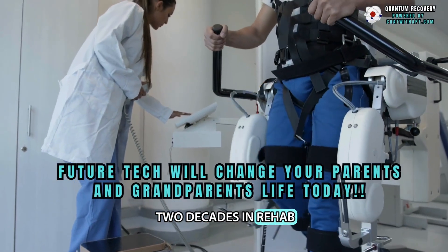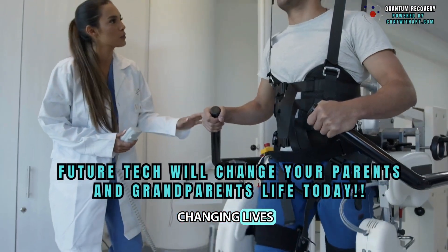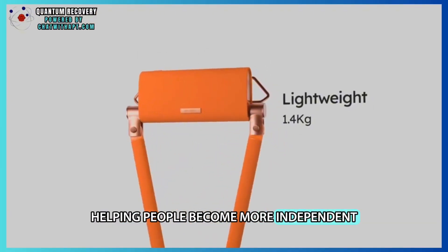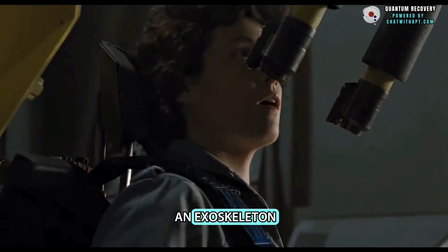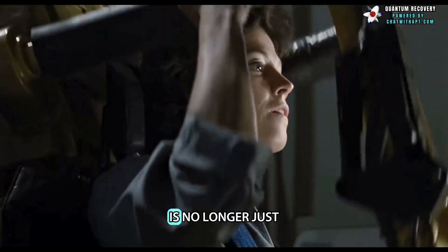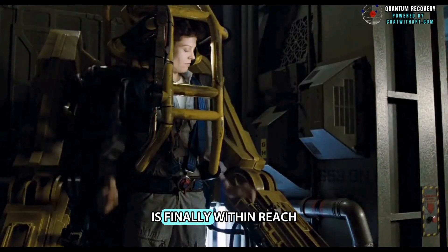Having spent the last two decades in rehab, it's exciting to see how modern technology is changing lives, helping people become more independent and making walking safer. An exoskeleton, like the ones we see in movies, is no longer just a dream. The one we're reviewing on this channel is finally within reach.